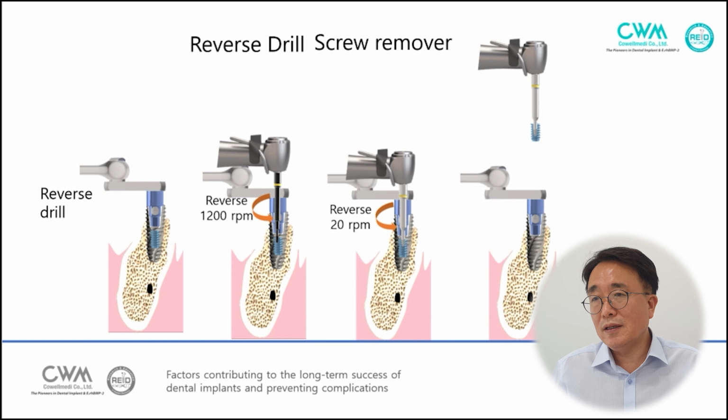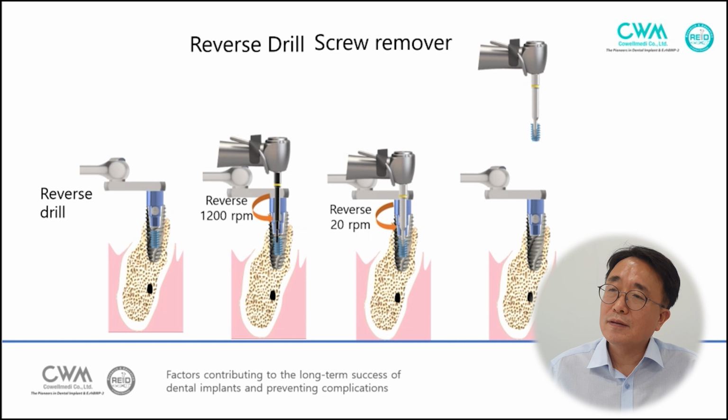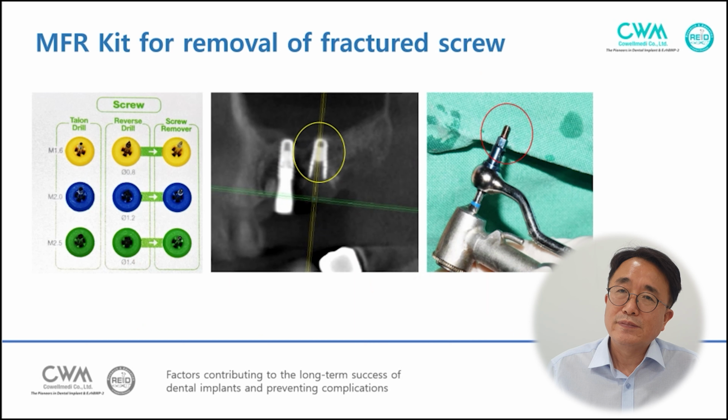And this screw remover is cold welded into the hole of the screw, and the remover turns, the screw is unscrewed, so we can remove it.